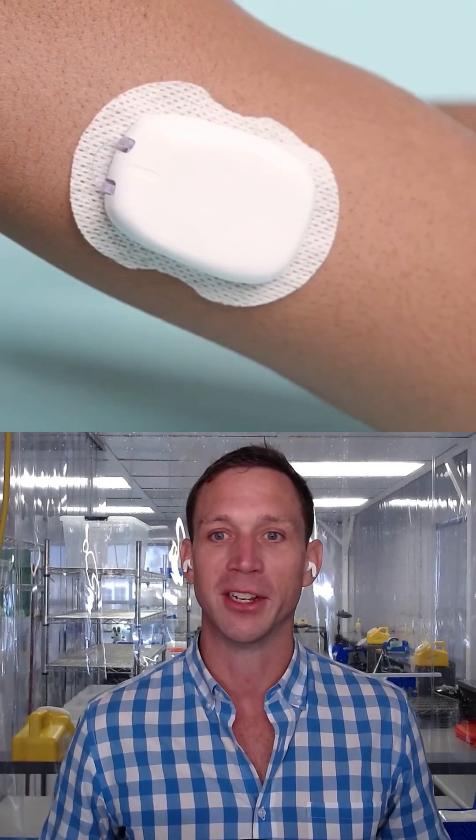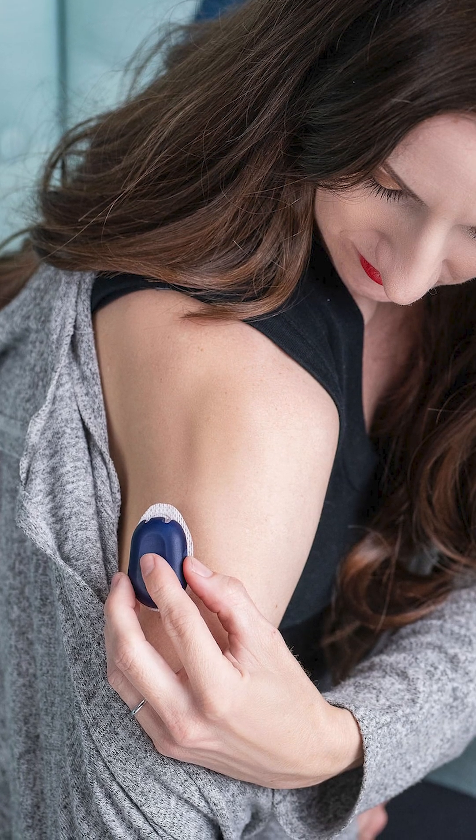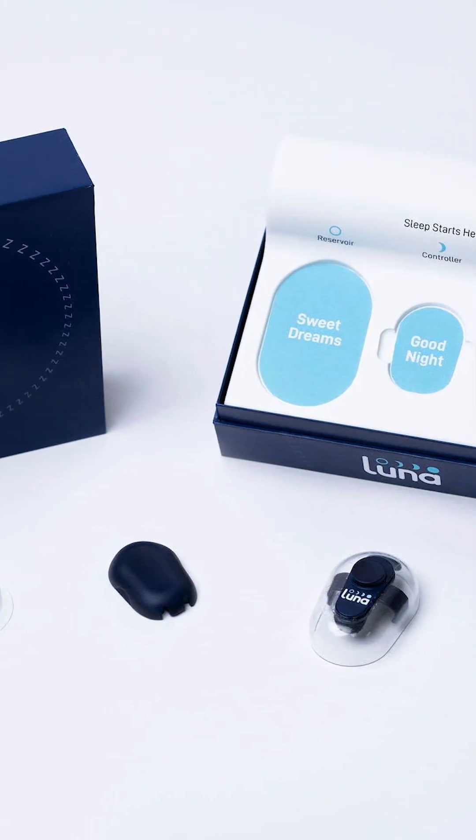And remember, you're using it once. Unlike most people with pen needles — and I don't recommend this — but who are using that same pen needle 10, 15, 20 times, you have a fresh, perfect needle. So you don't even feel it.